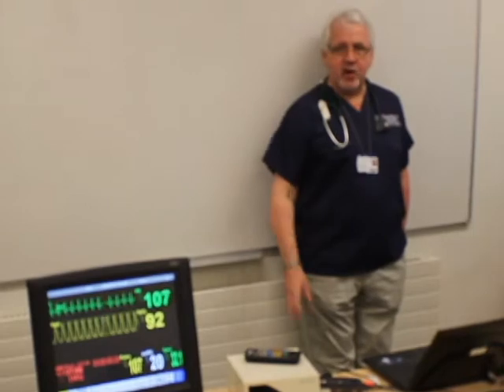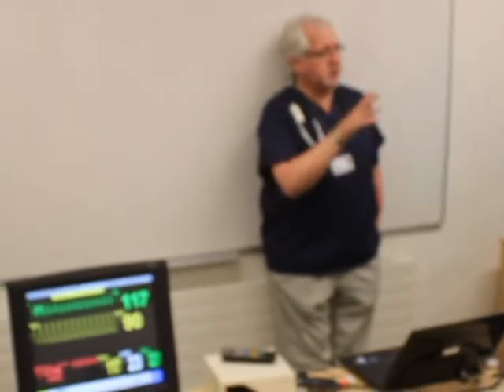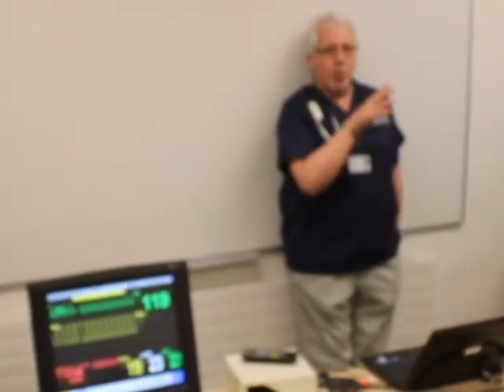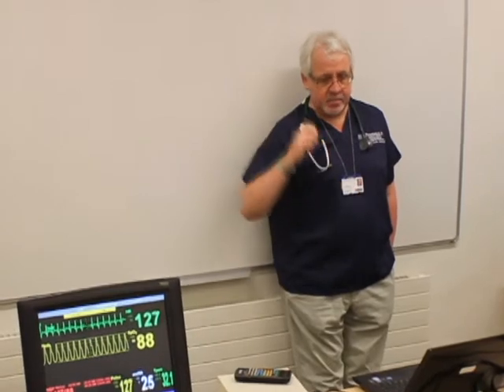And before very long we're going to see changes that are going to set the alarms flashing, and that will be telling us that major problems are arising. With the students in the simulations, they'll be hearing that, they'll be thinking, what's happening? Why is this happening? What's occurring with this patient? What am I going to do about this? And they'll talk to each other, they'll share ideas, they'll start thinking about what interventions do we need to take.